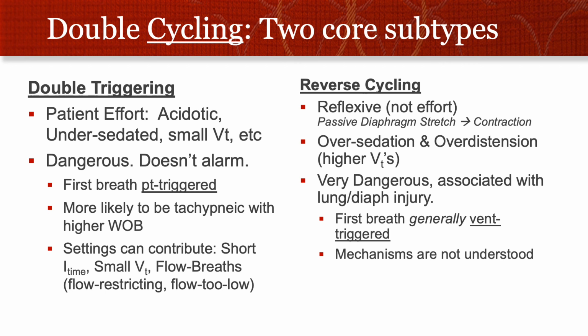It's a very dangerous dyssynchrony, and it is likely more dangerous than double triggering. It's associated with lung and diaphragm injury. These are hard to identify, but if you rule out some of the double triggering phenomenon, you are left thinking it might be reverse cycling.